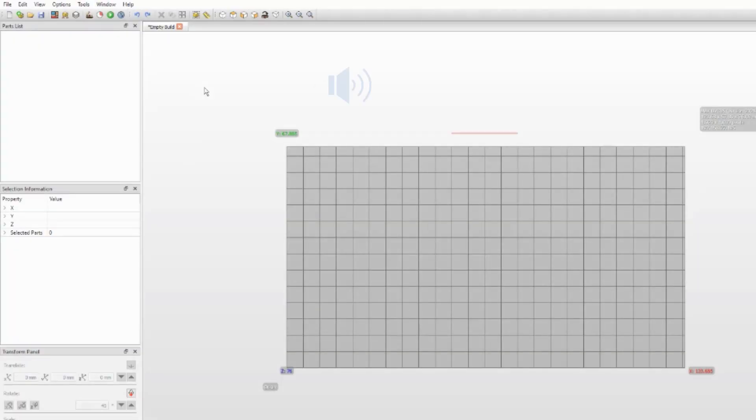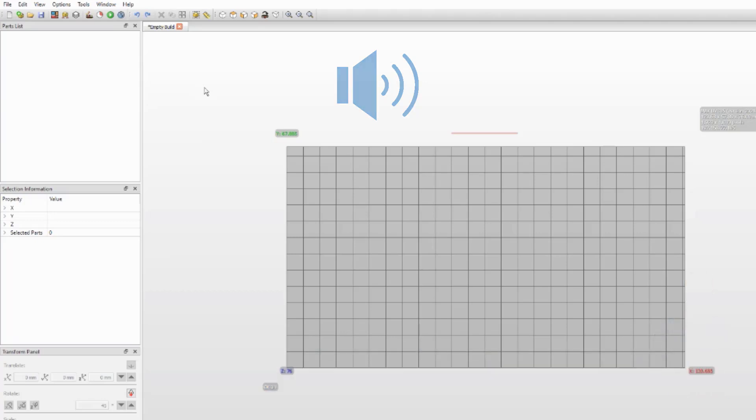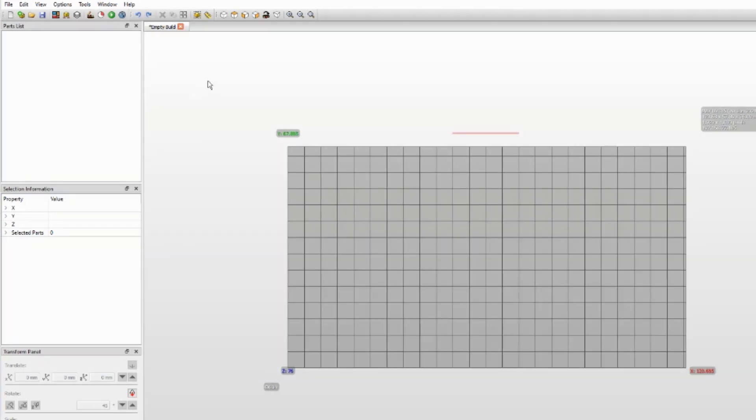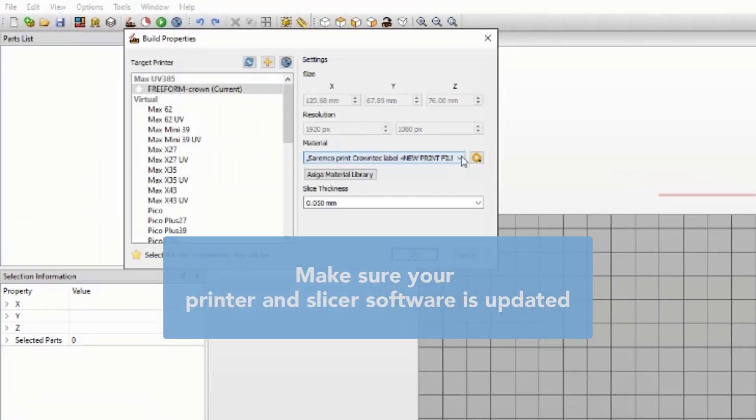So here we are starting the video right after the designing part. I am not giving you the only way to prepare a print with our material. There are experienced people out there who will give you even better advice, but here is a way that always succeeds with my prints.